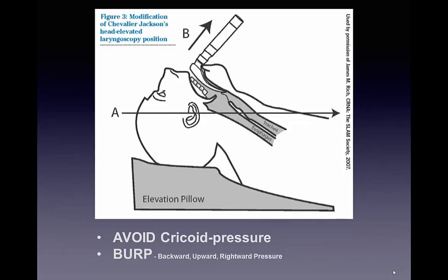The tongue is controlled as the blade stays midline. The blade is advanced slowly as the tip of that blade inserts into the vallecula. At this point, you engage in a gentle lifting action, which in some patients does require a fair amount of force, lifting the patient's chin forward towards the ceiling. It is good posture to have the left forearm tucked in towards the body during that time.